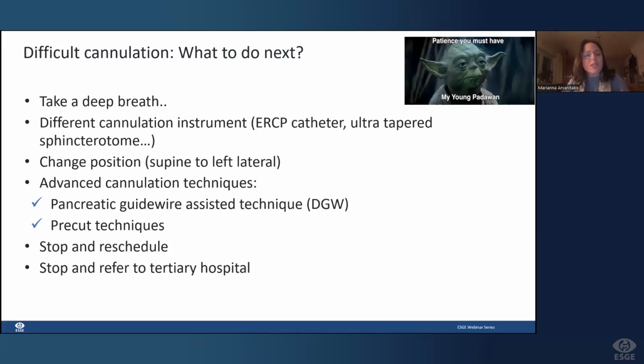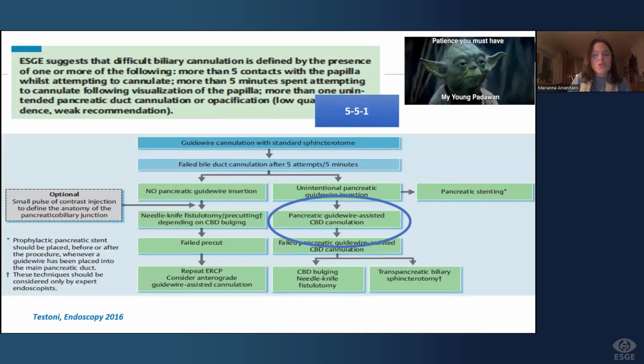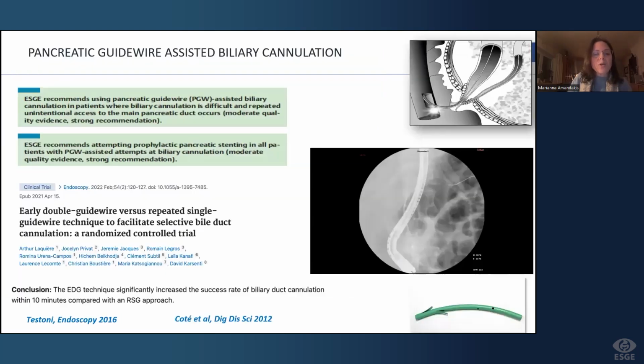And then we'll consider the advanced cannulation techniques, the pancreatic guide wire assisted technique, as I just showed you, and precut techniques, where expertise is required, of course, and will also be shown later. Consider the general clinical situation of the patient, because maybe you can reschedule. If a patient doesn't have cholangitis and has just raised bilirubin levels, maybe we can consider postponing for 48 hours or even refer him to one of your good friends and colleagues in another hospital. So this is where we are in the beginning of the algorithm for our advanced techniques.